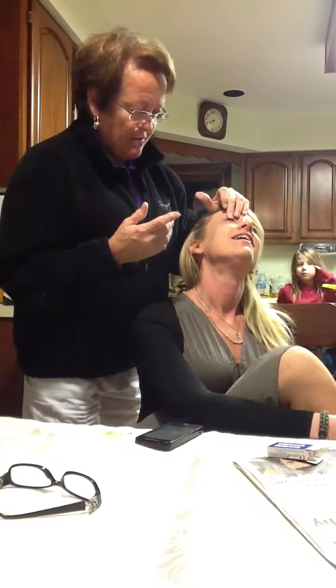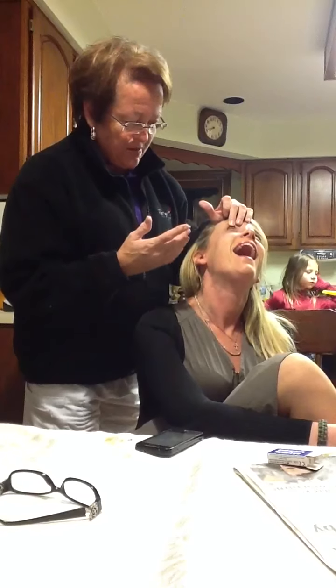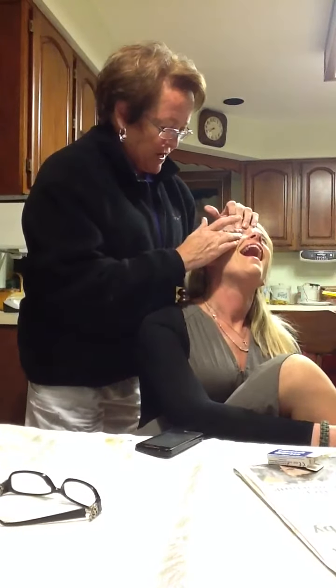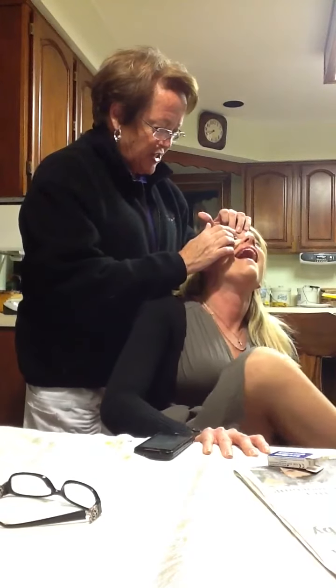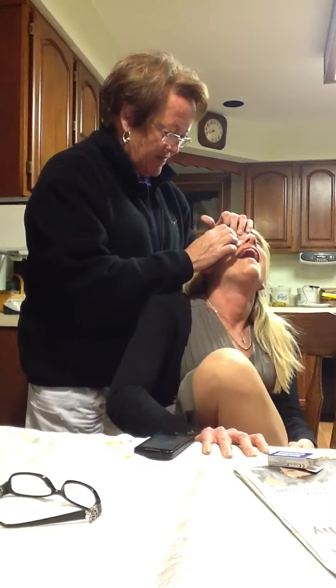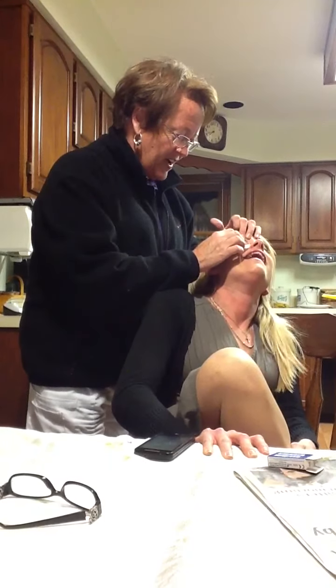Ready? You grab the upper lid. She opens her mouth. Why is she opening her mouth? You bring her lower lid down. Now she's opening her left eye. There we go.